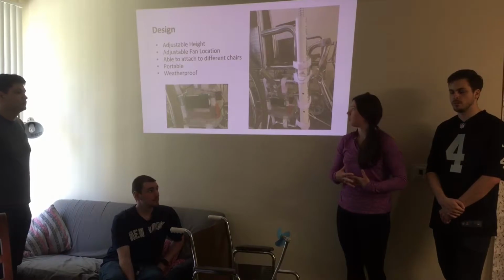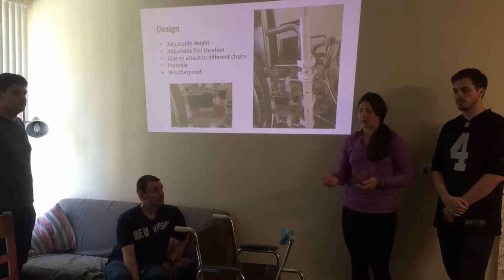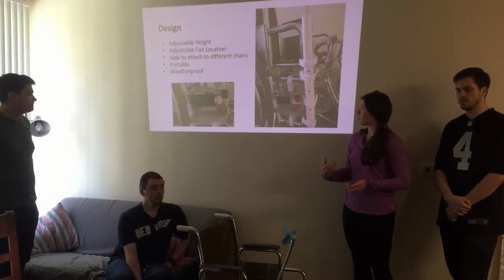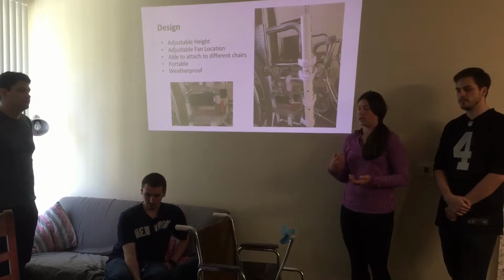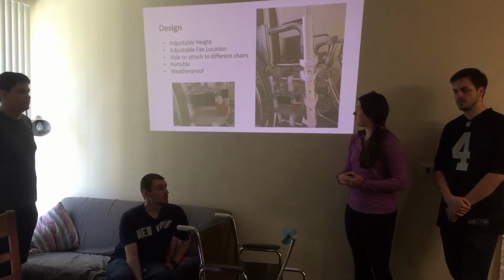It's also portable, which is why we decided to use the two 9-volt batteries so that you can use it on the go, and the batteries are pretty easy to change in and out if you happen to run out of power. It's also weatherproof. We used a plastic case to contain the Arduino and a lot of the wires. So in the future we're looking to make it more weatherproof, but for now we're getting there.